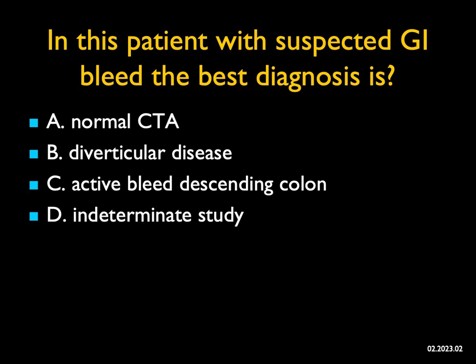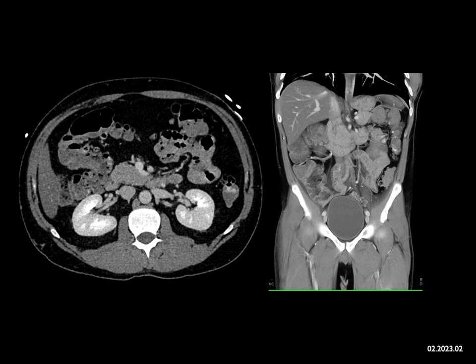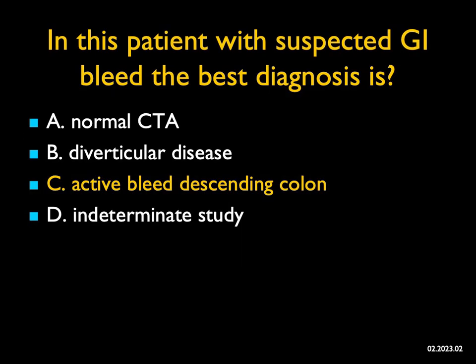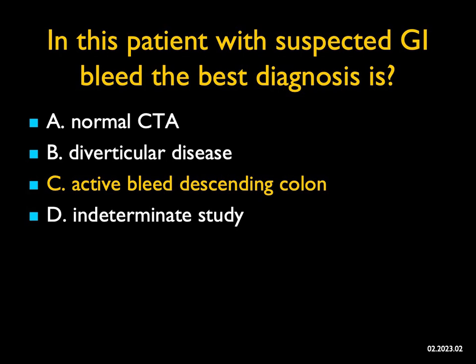In this patient with suspected GI bleed, the best diagnosis is? You know I'm not going to show you a normal study. The patient has probably some diverticular disease, but nothing very impressive, and it's surely not an indeterminate study. If you look at the descending colon mid-portion, you see a few diverticuli, but you also see high-density contrast in the lumen. This is a classic example of a GI bleed. We do arterial and venous phase imaging. Often the bleed will change extent between arterial and venous — most of the time becoming brighter in venous. When that happens, the chance of an angio being positive for therapy is very likely. This was a nice example of a GI bleed involving the descending colon due to diverticular disease.